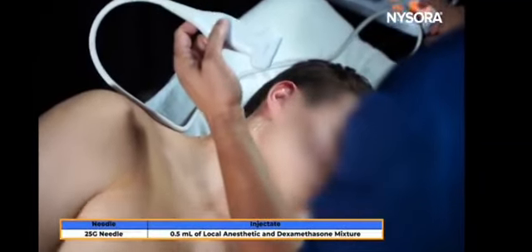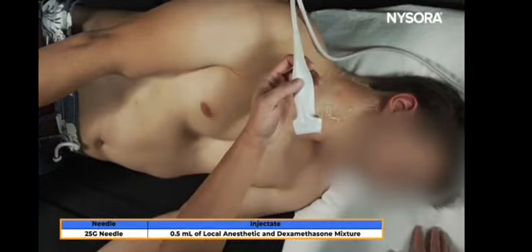The local anesthetic and steroid mixture, no more than 0.3 to 0.5 cc.